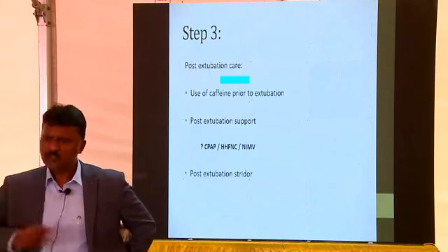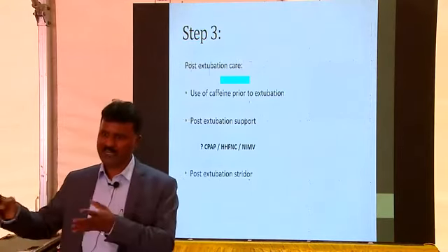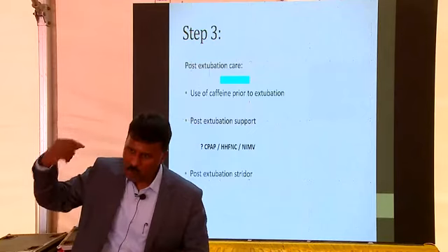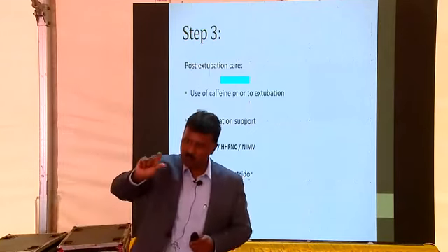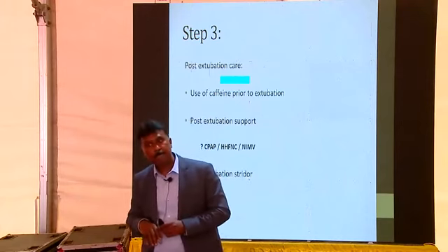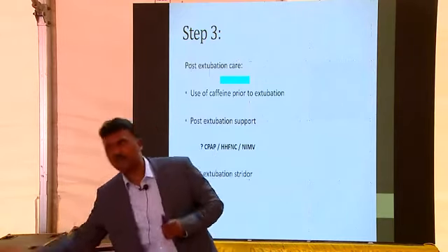See, once you put on NIMV, whatever mode you're going to put, it cannot synchronize unless you have an option to synchronize. So basically, what you're doing is nasal IMV. Whether you're putting on SIMV or CMV or IMV, it is basically IMV. That's what they say, but you are not synchronizing. So basically, it becomes IMV.